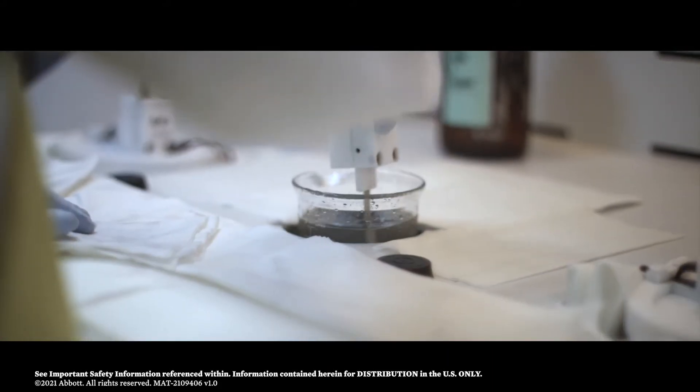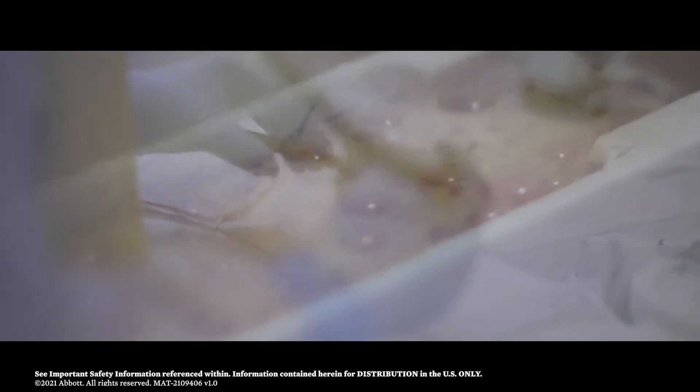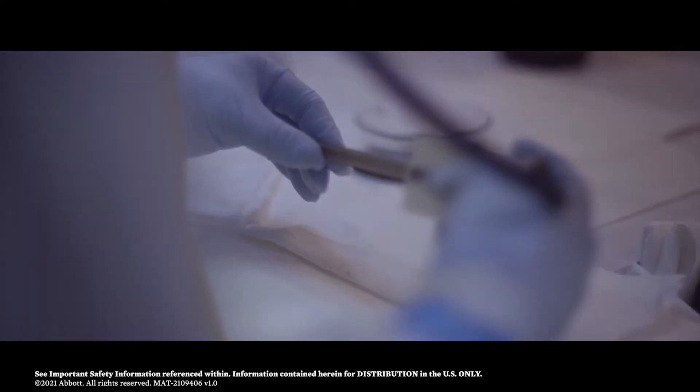Many stents also undergo a lengthy process of etching and polishing with strong acids to eliminate unwanted surface defects that may remove too much nitinol from the finished product.